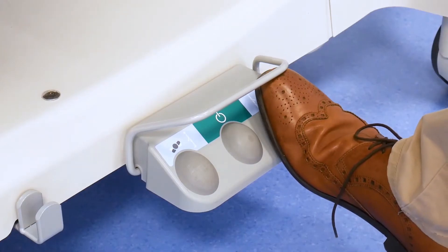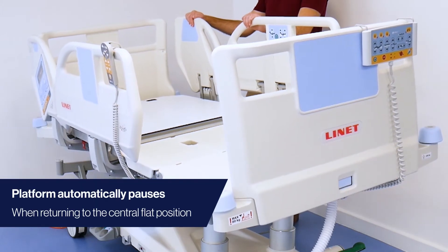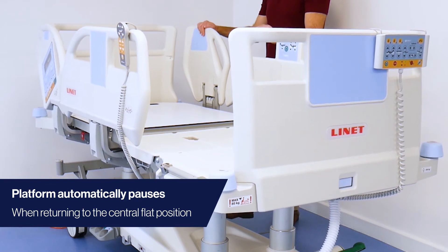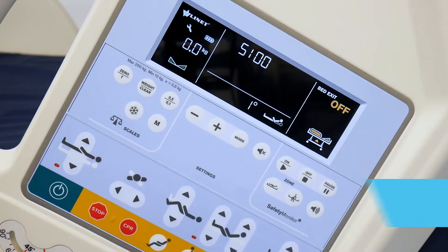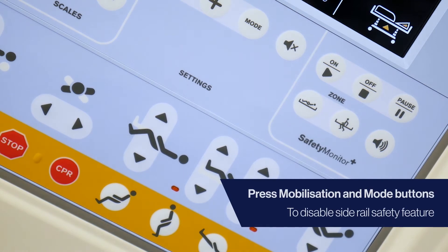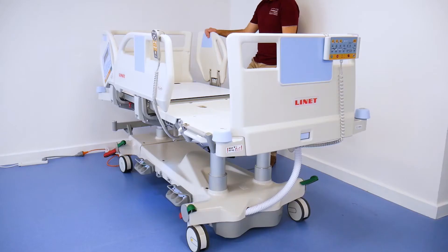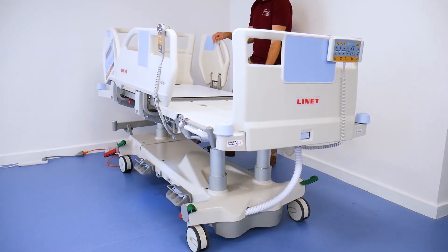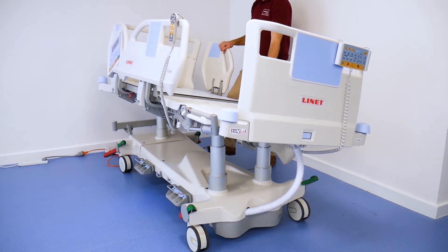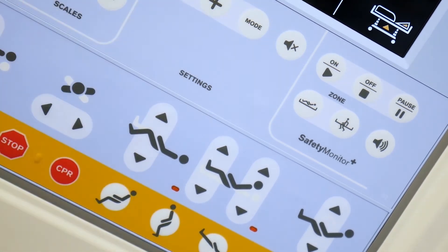The platform will automatically pause when returning to the central flat position. Please note that the bed will automatically prevent you from tilting if the side rails are down. To disable this feature, press and hold the mobilisation and mode button simultaneously until you hear a beep. Lateral tilt can then be adjusted even with the side rails folded down. To reinstate the alarm, press and hold both buttons again until there is a beep.